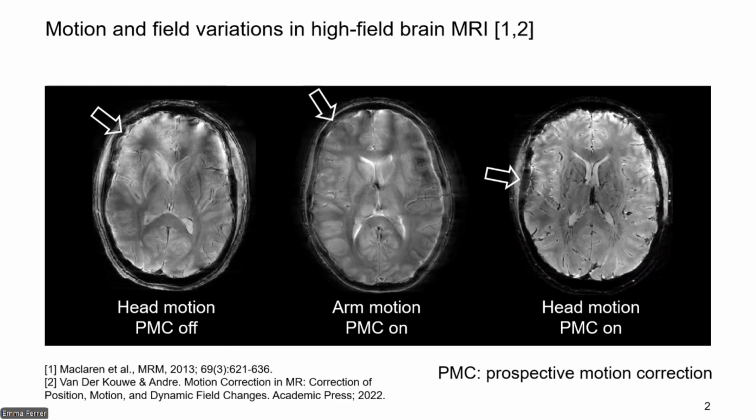So the frontal lobe is basically gone. And of course, the attainable resolution is limited by such effects. We are targeting this often in high field imaging, and therefore this is kind of a must if we do such methods. But even if we do motion correction and we do it well, the rigid motion is well resolved, like for example in this case, we see the interhemispheric fissure clearly, there are smearing effects here.